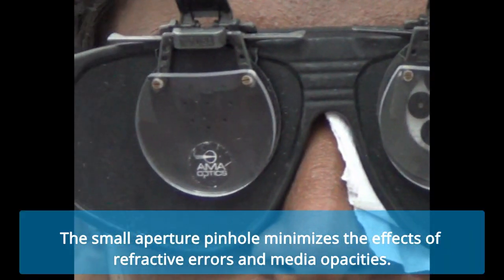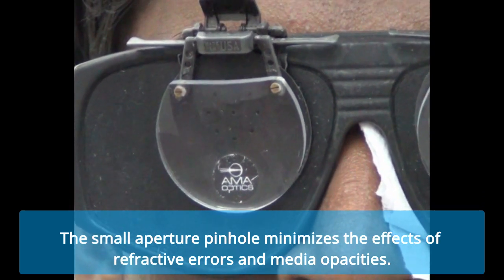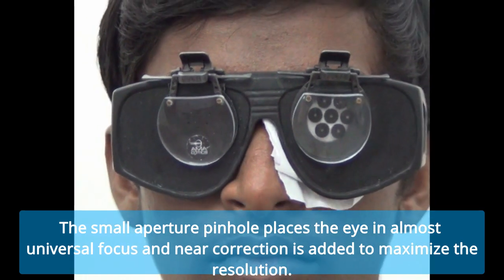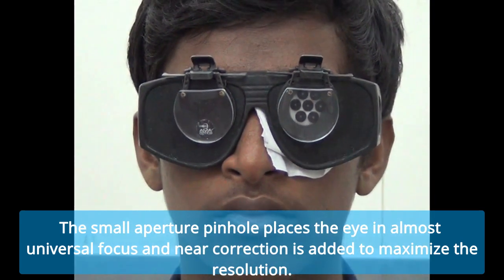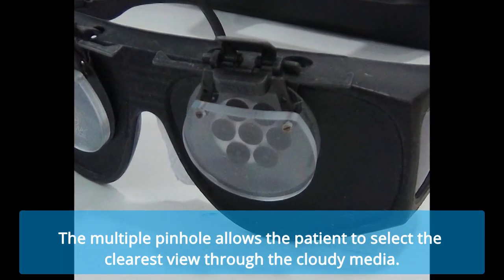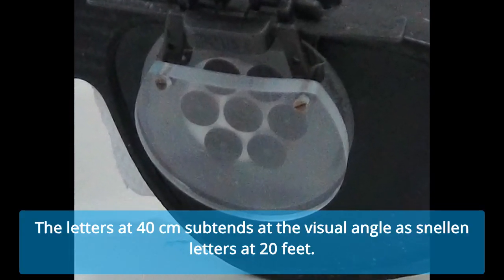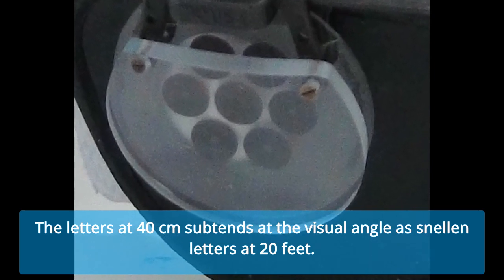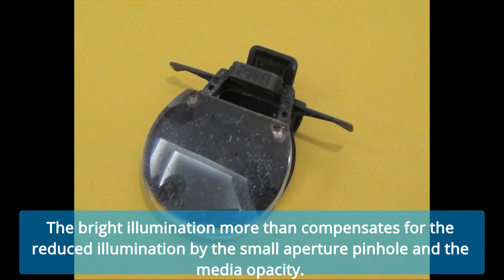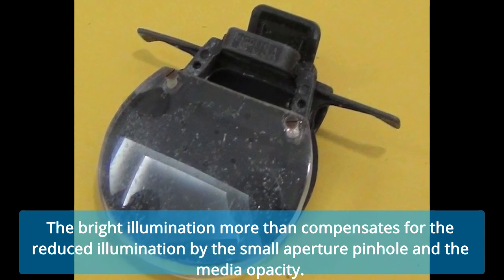The small aperture pinhole minimizes the effects of refractive errors and media opacities. It places the eye in almost universal focus and near correction is added to maximize the resolution. The multiple pinholes allow the patient to select the clearest view through the cloudy media. The letters at 40 centimeters subtend the same visual angle as Snellen letters at 20 feet. The bright illumination more than compensates for the reduced illumination caused by the small aperture pinhole and the media opacity.